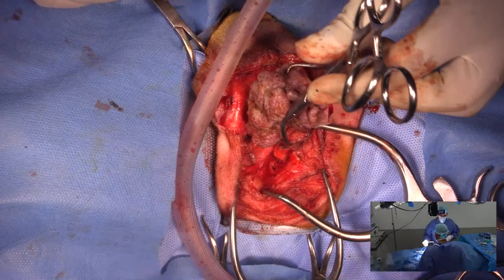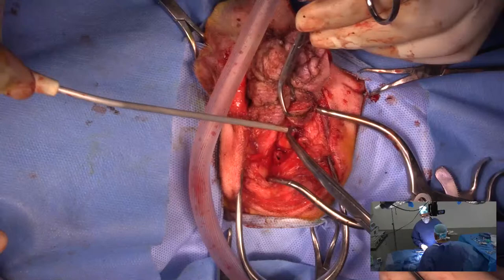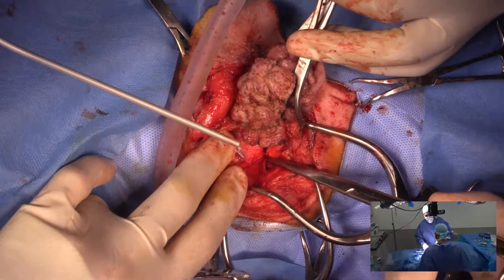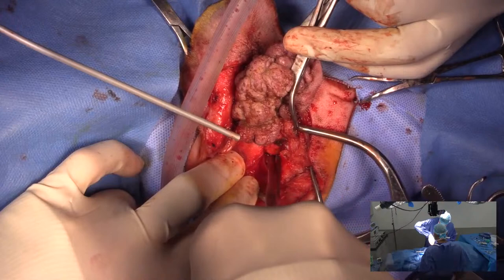So I'm not sure if you guys can see that ear canal right there. And there's exudate coming out of the ear canal right there. So I can palpate the bulla, the tympanic bulla right there. So, and I can see my facial nerve right there. I don't know if you guys can see that. That's the facial nerve sitting there. So I'm happy to go ahead and transect the ear canal.